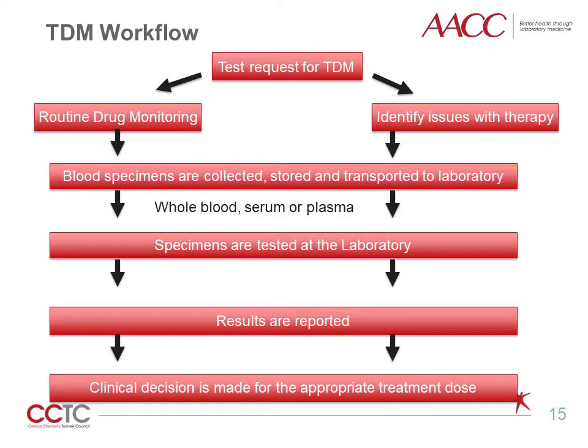A drug test is ordered for routine drug monitoring or to identify issues with drug therapy. Blood specimens are collected, stored, and transported to the laboratory. Specimens are processed and tested at the laboratory. Results are reported, and a clinical decision is made for the appropriate treatment dose.